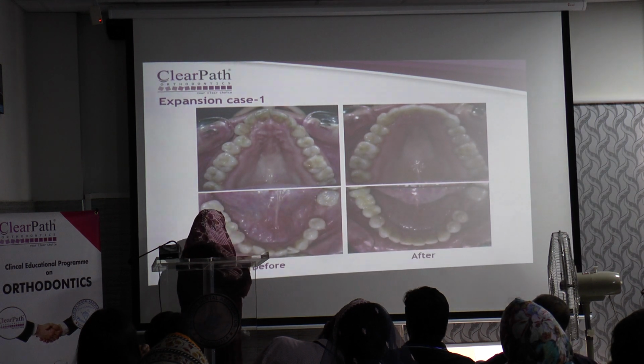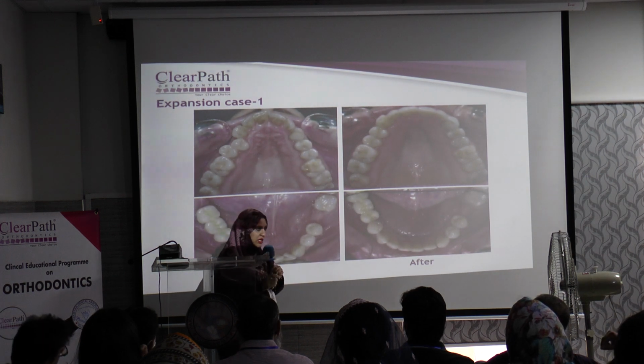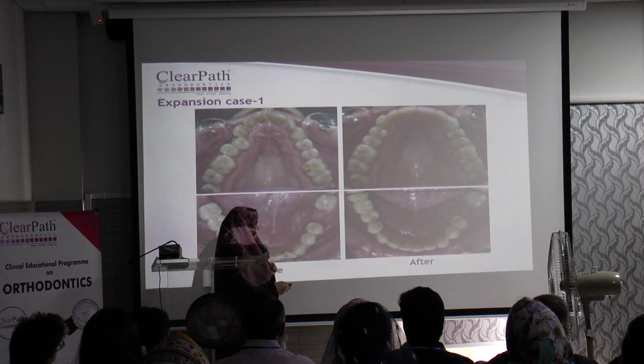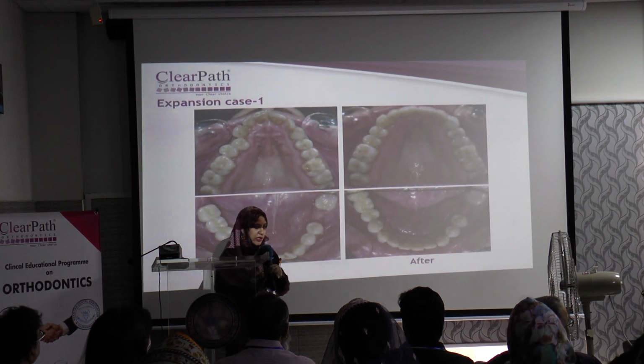This side we have the posterior region, but we have worked on the anterior region. In these cases where there is any bridge or prosthesis, we work on the anterior region. Okay? We can also give the sectional aligners just from canine to canine or 3 to 3.